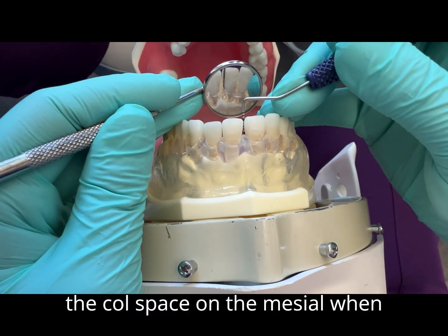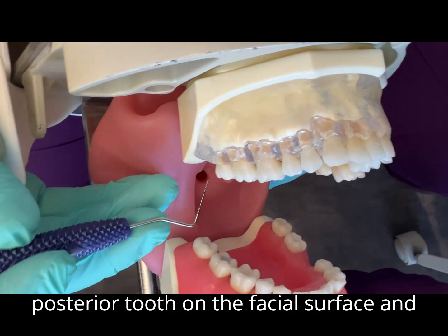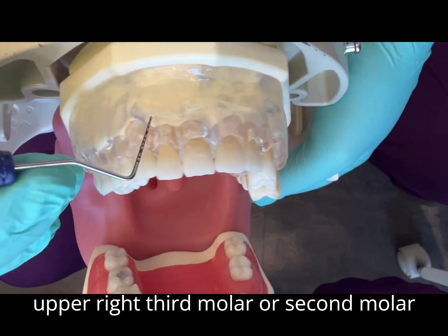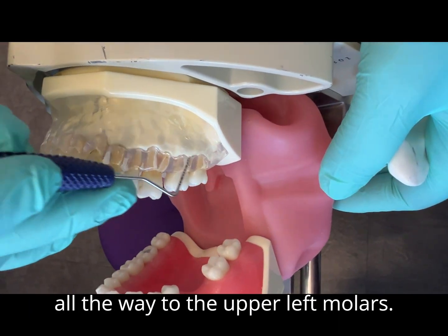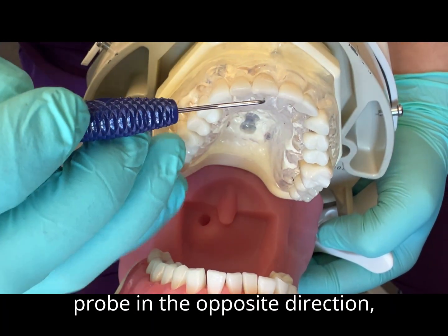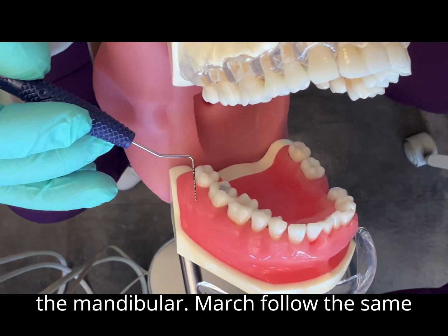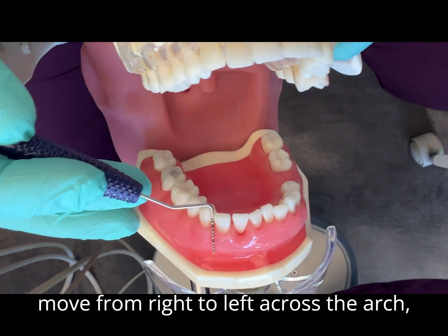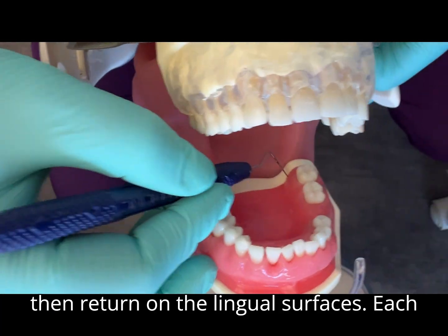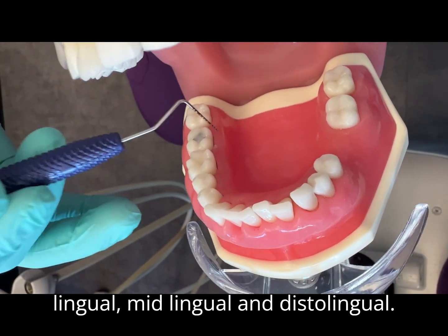When recording in Dentrix, probing starts from the distal line angle of the most posterior tooth on the facial surface and proceeds anteriorly, for example from the upper right third molar or second molar all the way to the upper left molars. After completing the facial surfaces, switch to the lingual surfaces and probe in the opposite direction, returning toward your starting point. For the mandibular arch, follow the same sequence. Start on the facial surfaces, move from right to left across the arch, then return on the lingual surfaces. Each tooth must be probed at 6 sites: mesiobuccal, midbuccal, distobuccal, mesiolingual, midlingual, and distolingual.